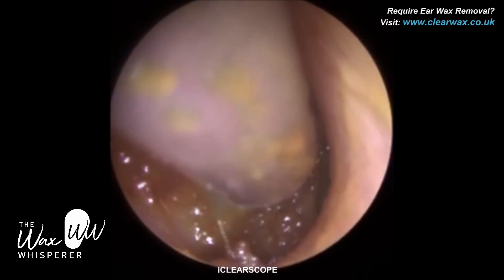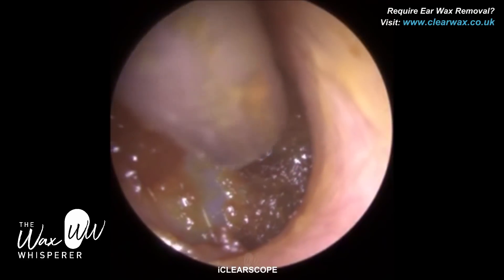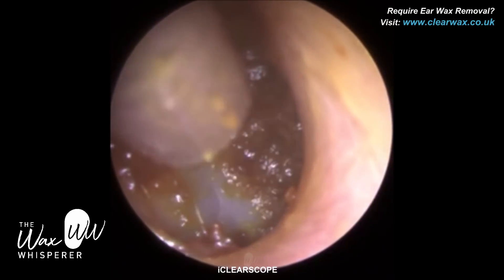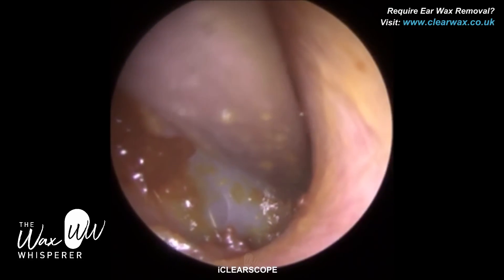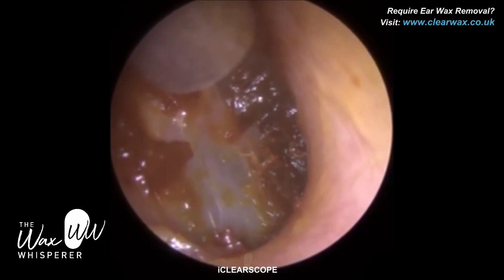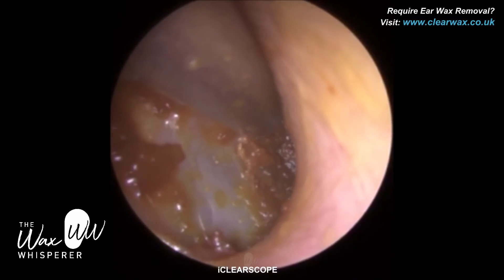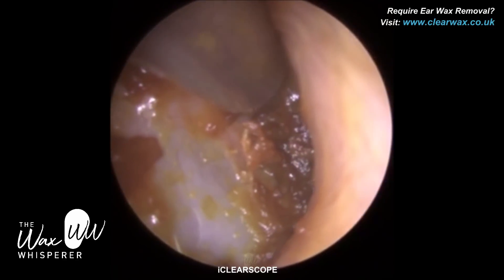So I couldn't work very close. Now this is the iClearScope in comparison. Everything else is the same — I used the same iPod, the same light source. The only difference is I attached the iClearScope endoscope. You can just see the difference, not only in brightness and clarity, but also the magnification. Although the previous endoscope, Endoscope A, was shorter in working length, that actually ended up being a negative.